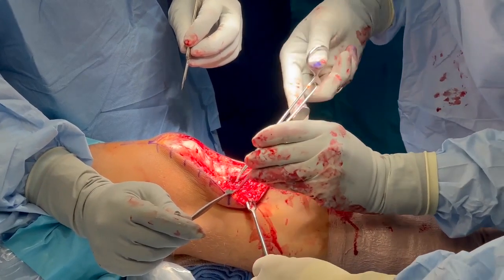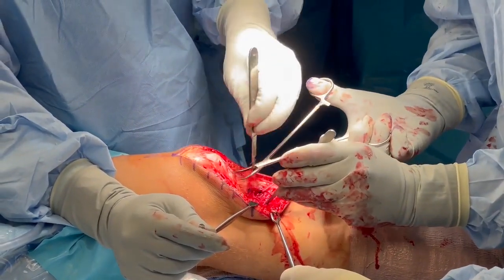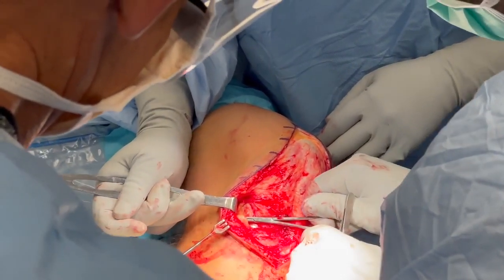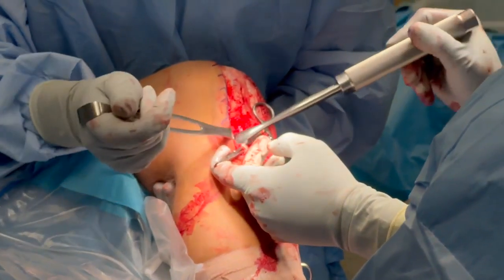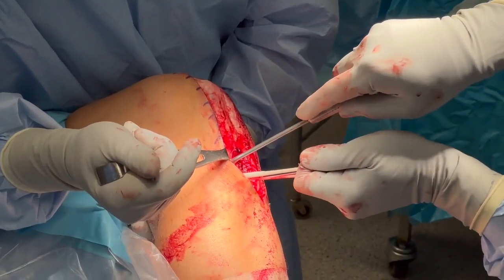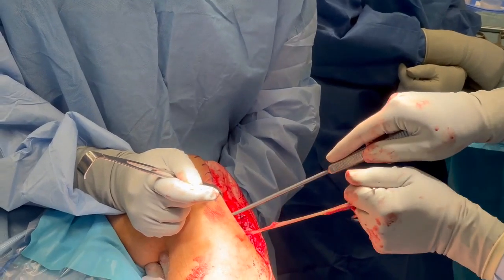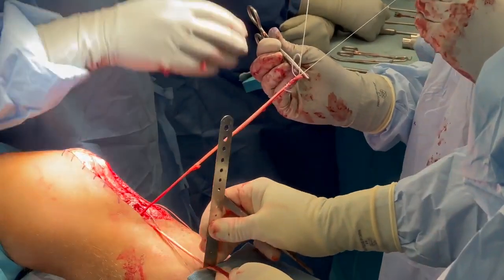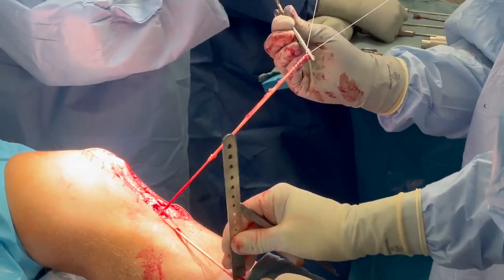Next, graft harvest of the hamstring autografts was performed. A dissection was carried out to expose both the gracilis and semitendinosus tendons. The tendons were isolated and the adhesions were removed using a large cob elevator. An open hamstring harvester was used to harvest both grafts, which were left attached with their tibial insertions. A metal ruler is used to scrape residual muscle from the tendons and the ends are whip-stitched with number two non-absorbable suture.